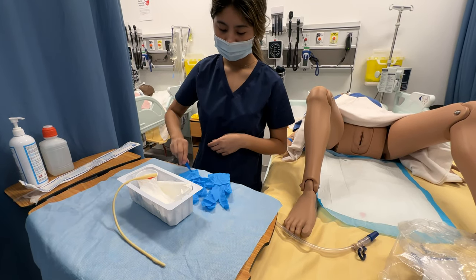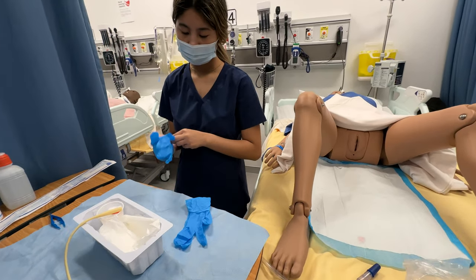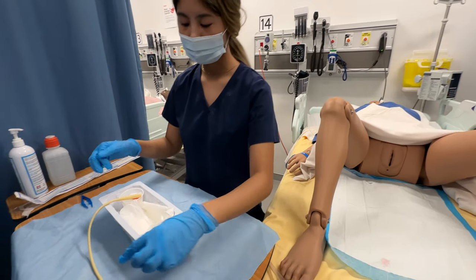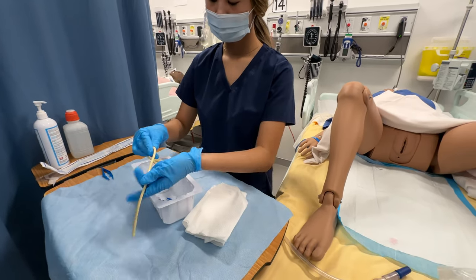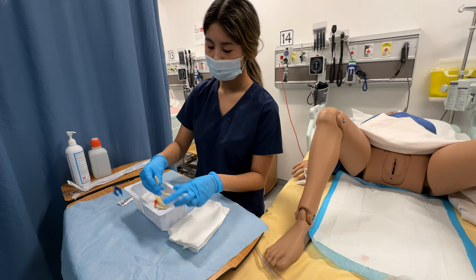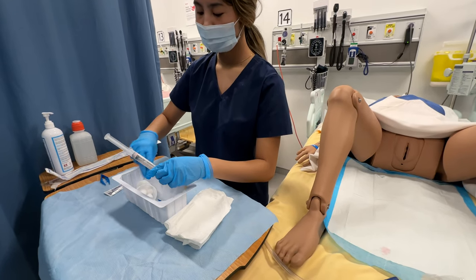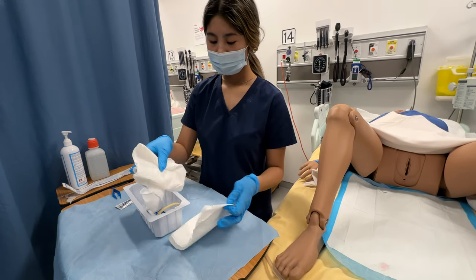I'm going to put on my gloves. I can touch anything in my sterile field. I have my lube and I'm going to put some on the side. I'm going to prep the catheter tip and then attach the syringe on the end of the catheter. I'll just put it in my sterile field, and I'm going to prepare my extended sterile field.